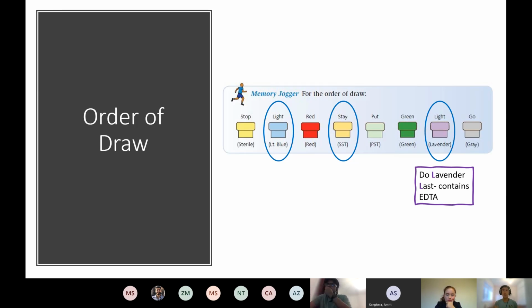So now that you're all apprentices, they might get you to take blood, in which case it's really useful to know what order to take the tubes in. There's lots of different colours here. So there's a mnemonic, but I think largely you'll be taking 3 different colours. It'll be a light blue, a gold, and a lavender. Always remember the most important thing, to take lavender last.